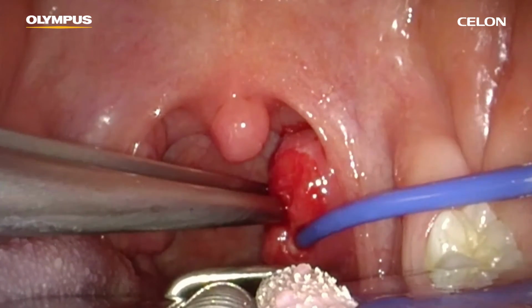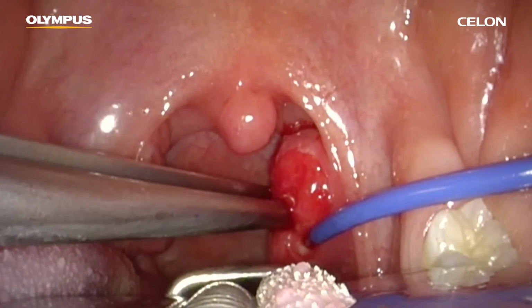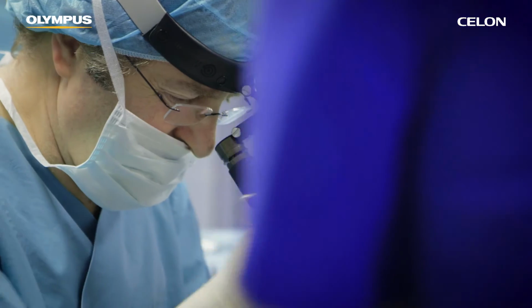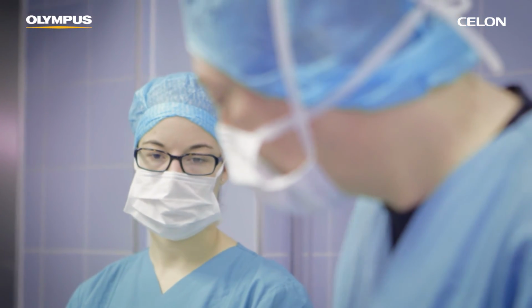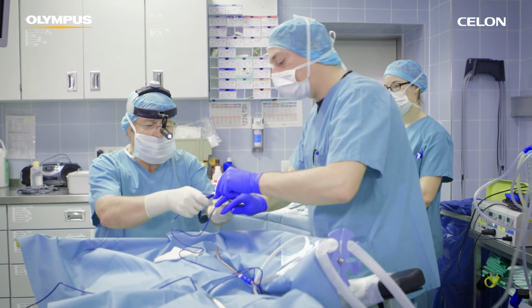If necessary, you can usually also perform an adenotomy during the same treatment session with no additional risks. Because of the risk of swelling, the child should be kept under postoperative observation for at least a couple of hours after the procedure. Treatment with the CELON method can be repeated 6 weeks later if required.